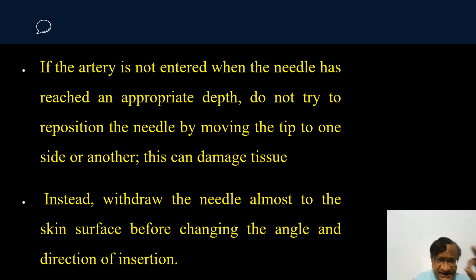If the artery is not entered when the needle has reached the appropriate place, do not go tick, tick, tick, tick. Do not do that. Remove and then go again. Don't manipulate in the depth. Do not manipulate the needle in the depth.